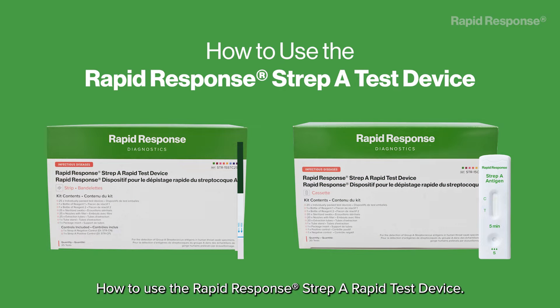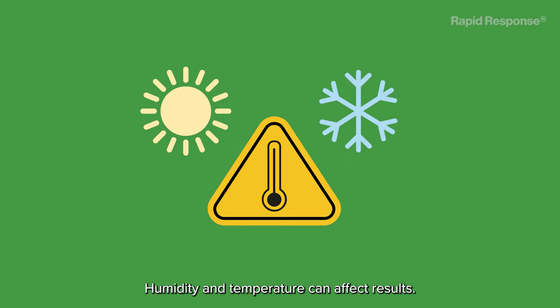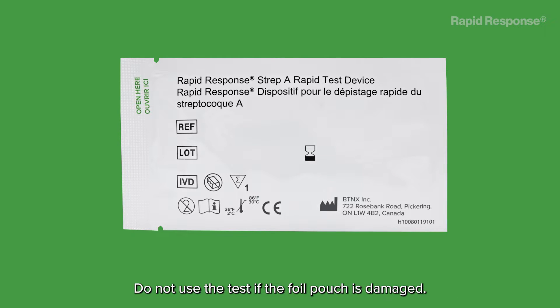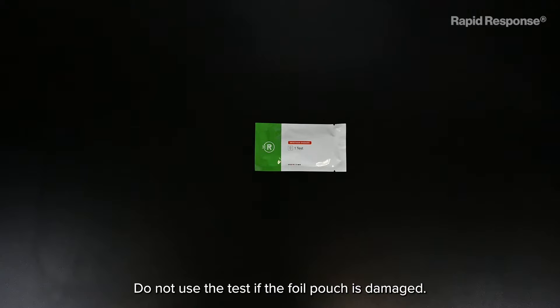How to use the Rapid Response Strep A Rapid Test Device. Humidity and temperature can affect results. Do not use after the expiration date printed on the back of the pouch. Do not use the test if the foil pouch is damaged. Bring the test to room temperature before use.